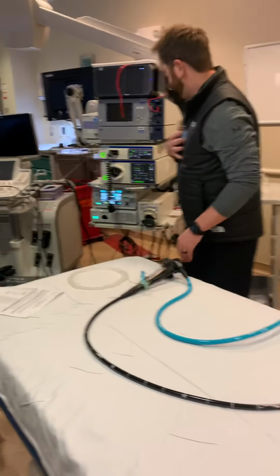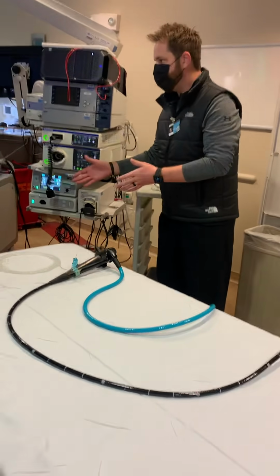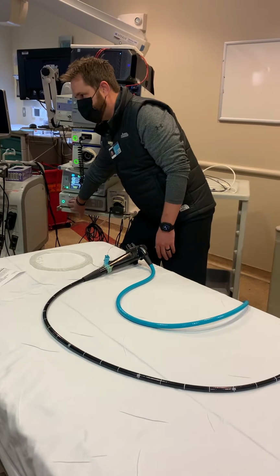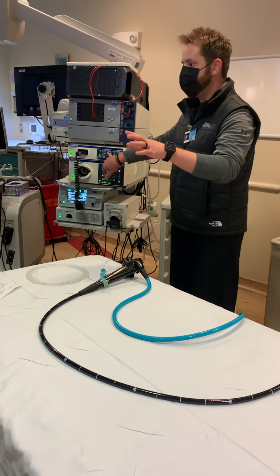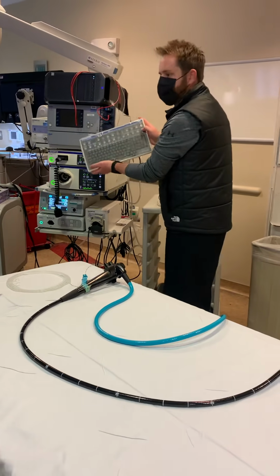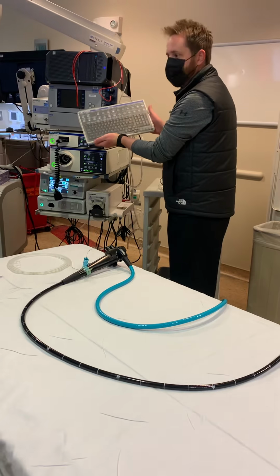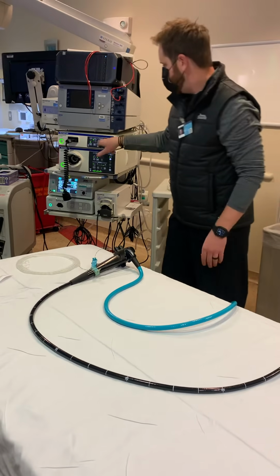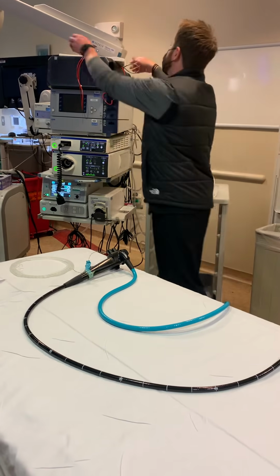So what I would do is if your physician says, we're going to do a Spyglass case in the next ERCP, I would come in, make sure Spyglass is on, press custom 1, make sure that you're getting a picture-in-picture image. If you aren't, it means you've got to go to menu, go to user settings, and then pick ultrasound. Once you pick ultrasound, then you can come back, custom 1, make sure you get your image to pop up.